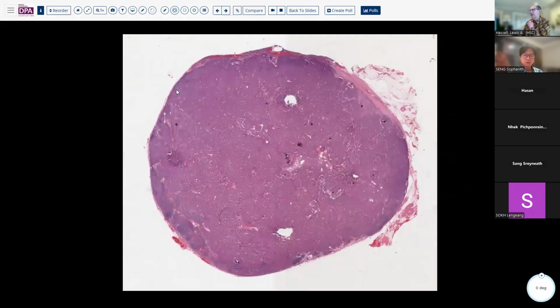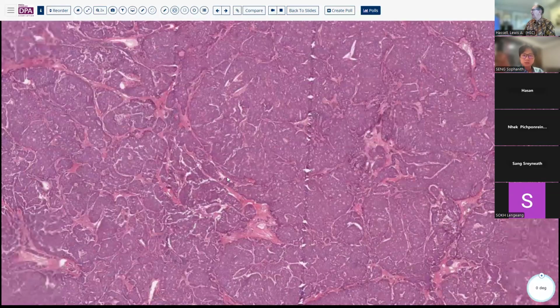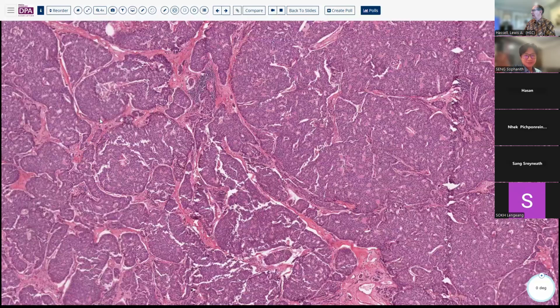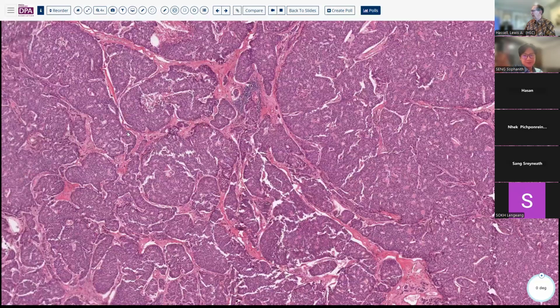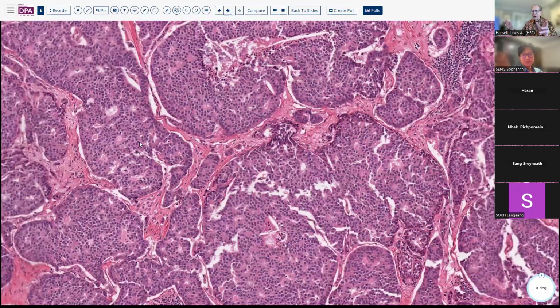Okay, in the last couple of minutes, let's move on to a couple of other neoplasms. Certainly no discussion of the mediastinum would be complete without mention of other neuroendocrine tumors. We've mentioned paragangliomas, but we also can have primary neuroendocrine lesions in the thymus and mediastinum, which would classify as carcinoid tumors.